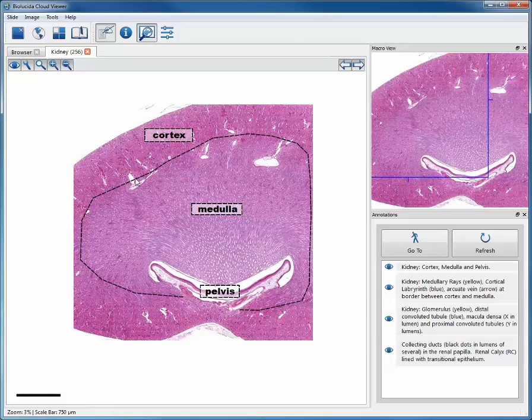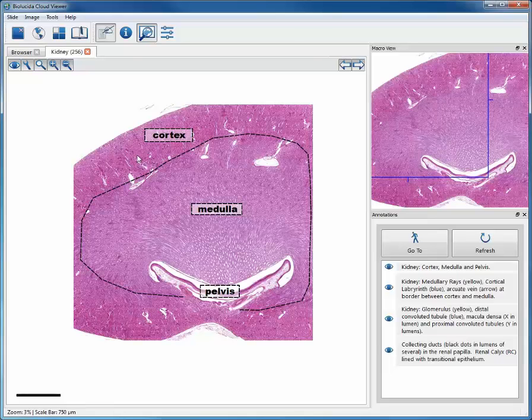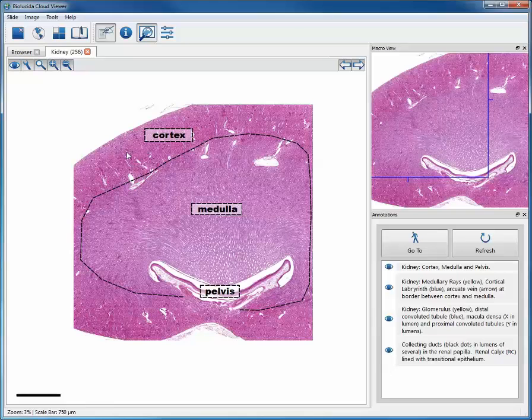Notice the difference in staining characteristic and intensity between the cortex and the medulla. There are many more cells here that are eosinophilic than here. There are many more nuclei and they are closer together in the medulla. That's why you see a more reddish stain in the cortex and a more bluish stain in the medulla.